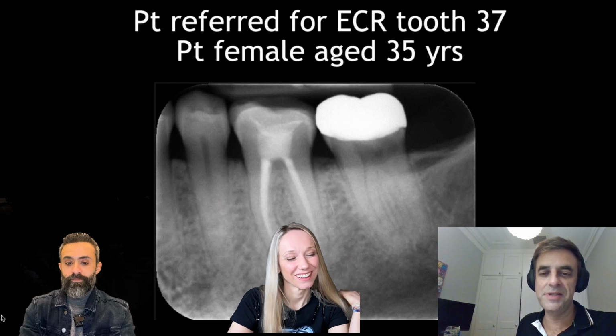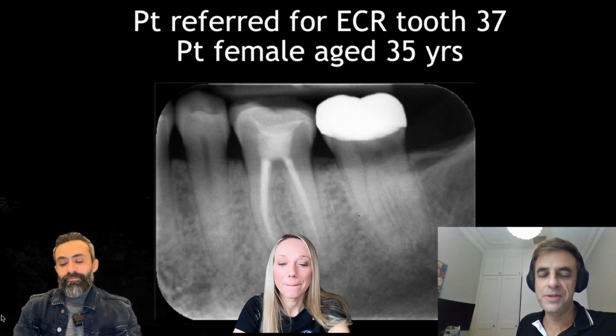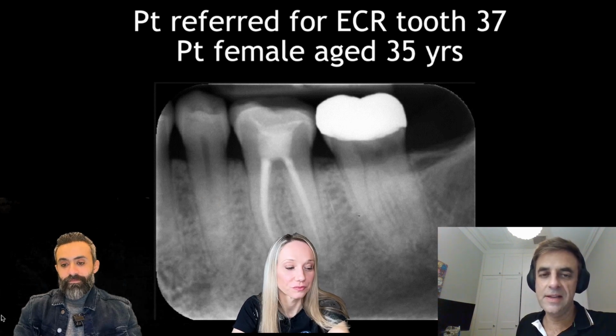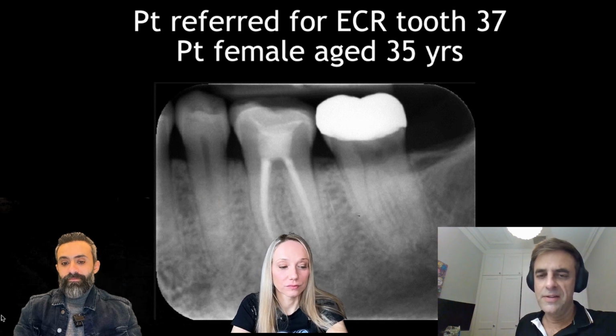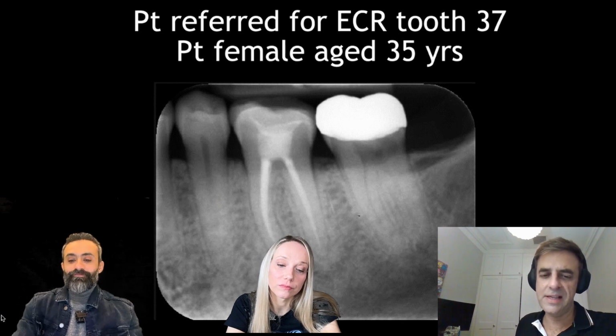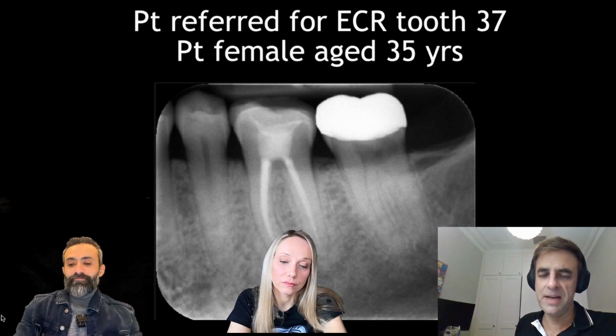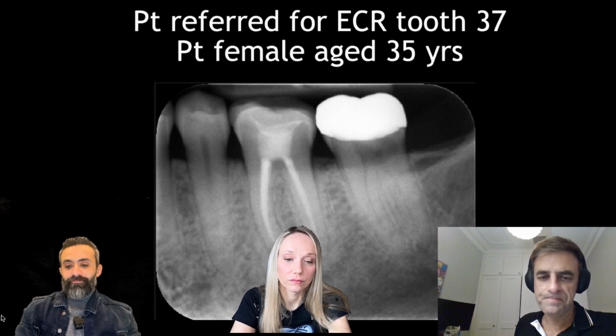Here's another interesting one. This patient was actually referred for external cervical resorption of the last tooth there, the second molar, and they came in and I looked at the tooth and I thought that there's no symptoms with the second molar, but the first molar has a periapical lesion and is symptomatic, and it had been root filled 12 months earlier.